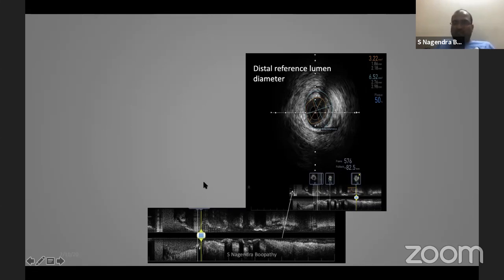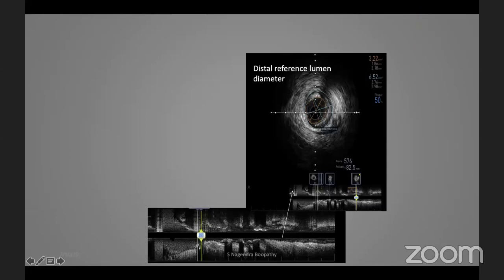So the option here, what we did in this particular patient, was a left main to LAD provisional stenting strategy, assisted by rotablation with two burrs, 1.25 here and 1.75 here. We placed two stents, a 2.5 into 38 here, and a 3.5 stent, 3.5 into 23 here, and overlapped it, and post dilated the segments well.